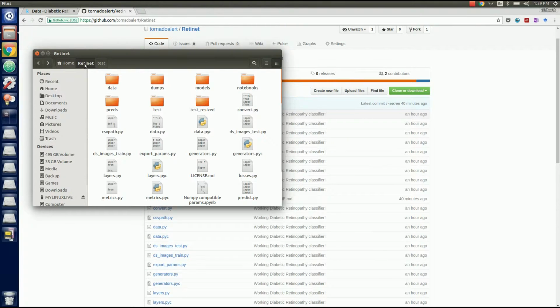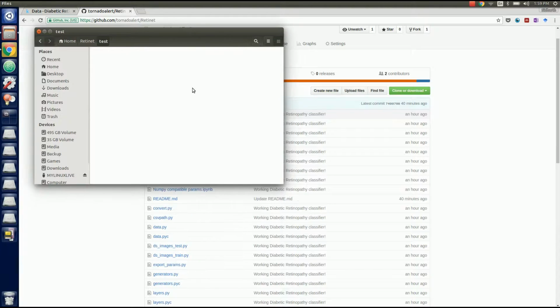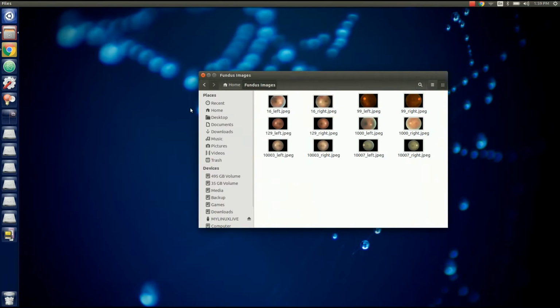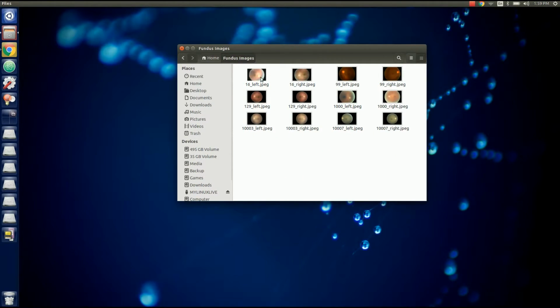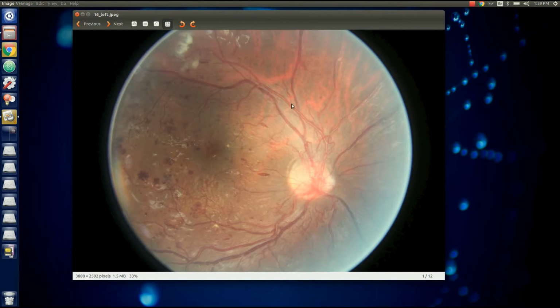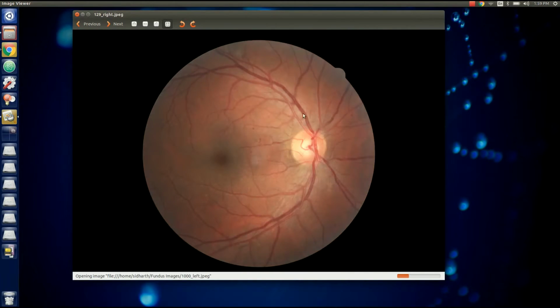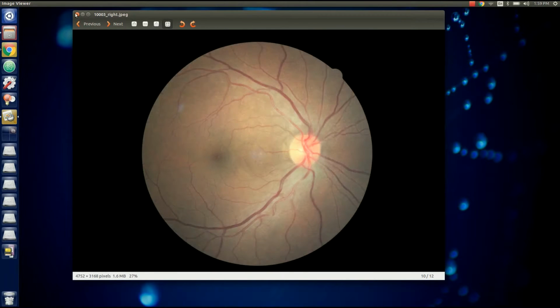It's called Retinet. And open the test directory. So once you did that, you can see that it's empty right now. So we will get some fundus images. Let's see. This is a typical case of proliferative diabetic retinopathy. This too. So I have some other images here. Normal. That's a variety of images.